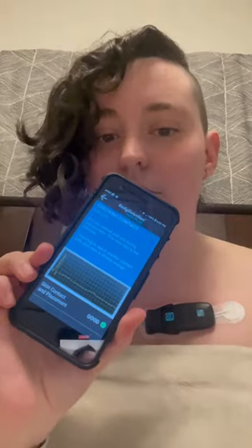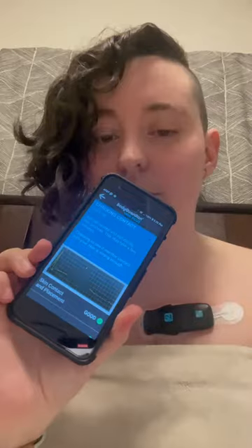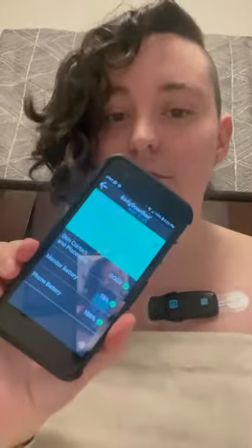This is the Bodyguardian mini strip, and it is a Holter monitor I'll be wearing for 30 days. As you can see here, it's reconnected and I am good to go.